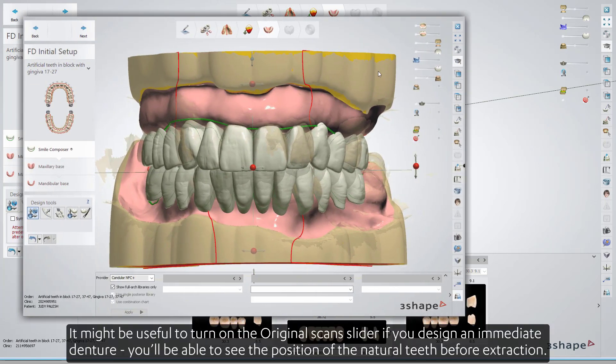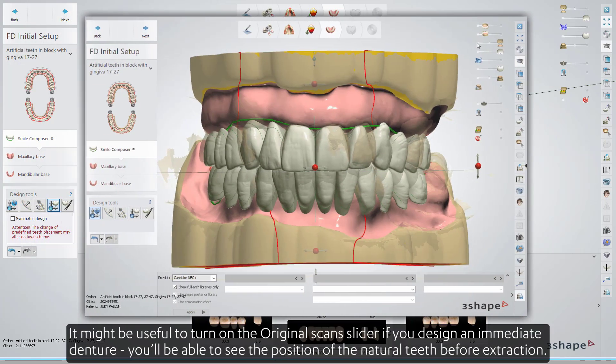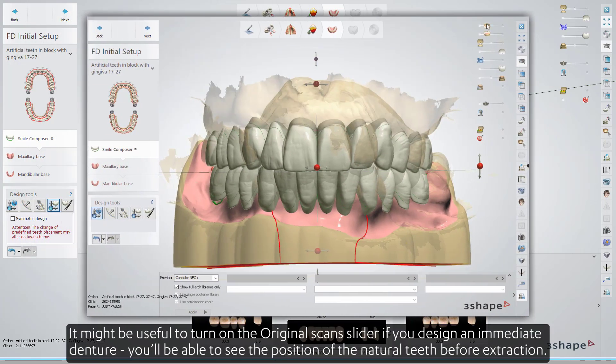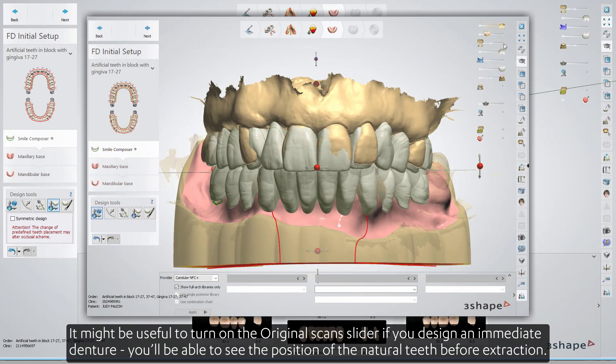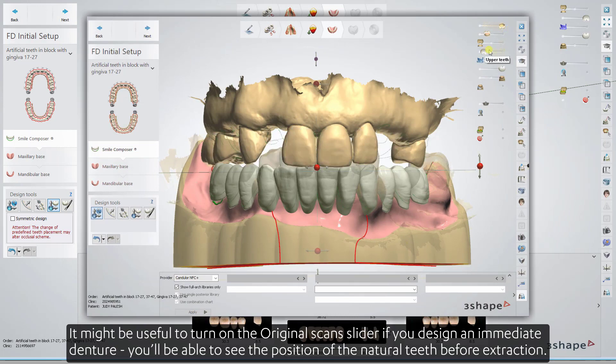It might be useful to turn on the original scan slider. If you design an immediate denture, you'll be able to see the position of the natural teeth before extraction.